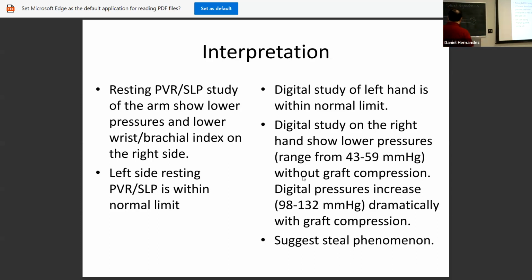We also have the ulnar artery trying to help out as well, if we're utilizing the radial artery. So that should also be bringing blood flow down towards the hand. But again, some patients might have an incomplete palmar arch. That fistula might be too large or too strong, where it's drawing too much blood into the venous system and not enough blood flow is continuing down that radial artery towards the hand. And it might be so strong where it actually creates retrograde flow, where we might wind up with flow reversal going in the opposite direction, so actually stealing it from the hand.